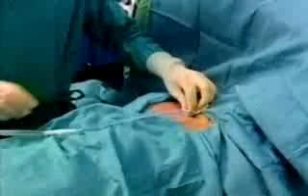In placing the suture, care must be taken to avoid puncturing the drain. We do not use purse string stitches because tightening is painful and because residual scarring is less cosmetic. A dressing is applied at the end of the procedure. The drain can be removed 2 or 3 days after the procedure.